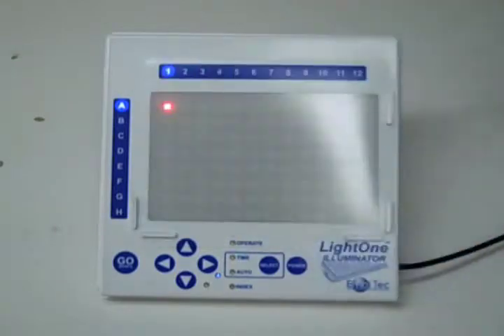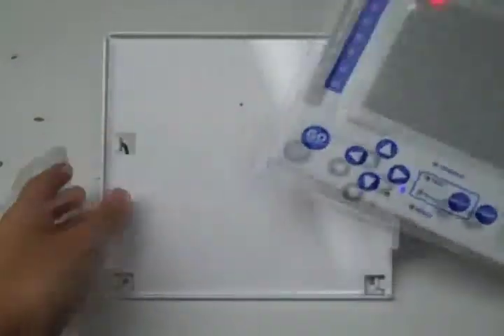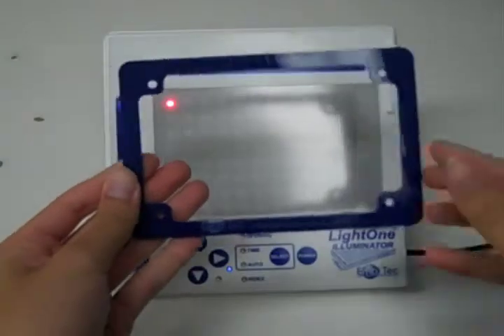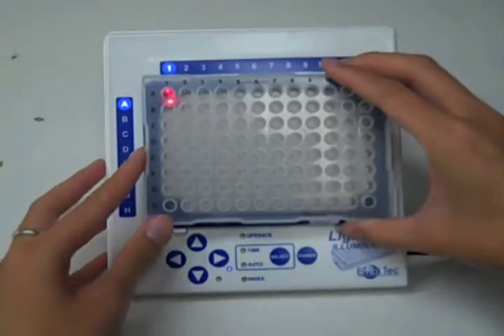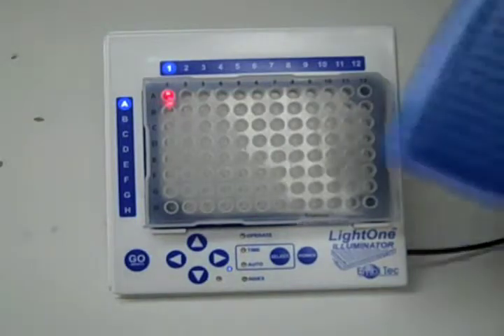This is what it looks like. It includes the LightOne unit itself, a stand, a viewing frame, and a foot pedal.